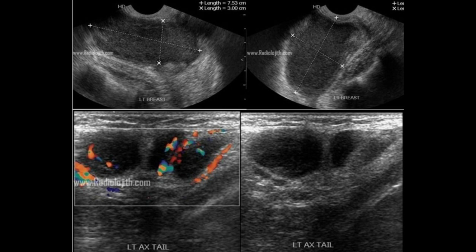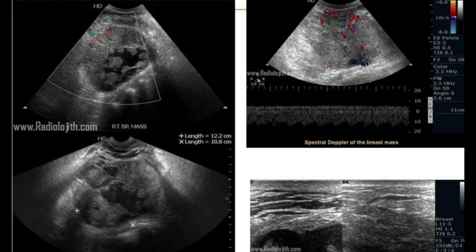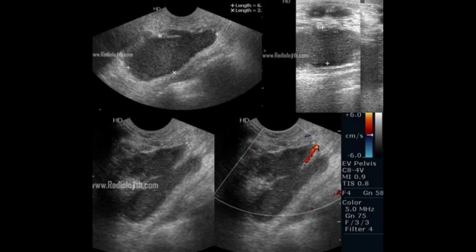If you want more time, please pause the video and review again to assess the sonomammographic images. Within a few seconds, I will give you the findings, the differential diagnosis, and the final diagnosis. Are you ready?